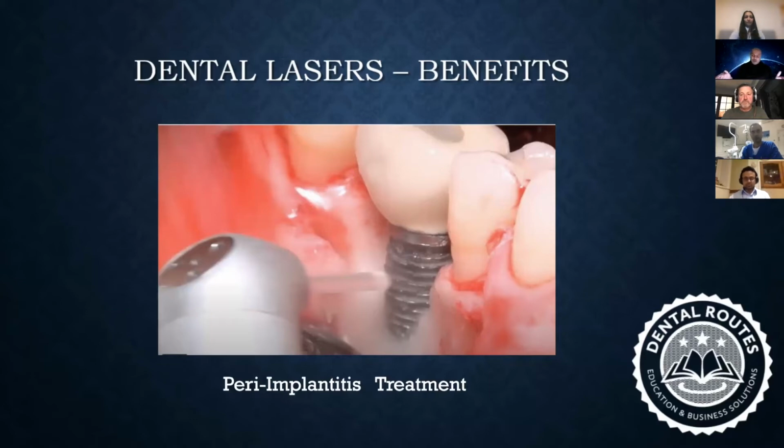With dental lasers, we call it APDT, or antimicrobial photodynamic therapy, where we use certain dyeing agents which the bacteria preferentially absorb, and then we use certain laser wavelengths, which the bacteria then absorb because they would have absorbed the dye already.